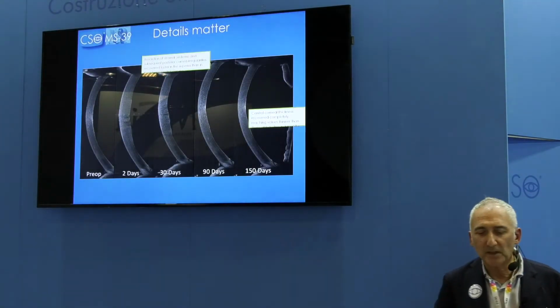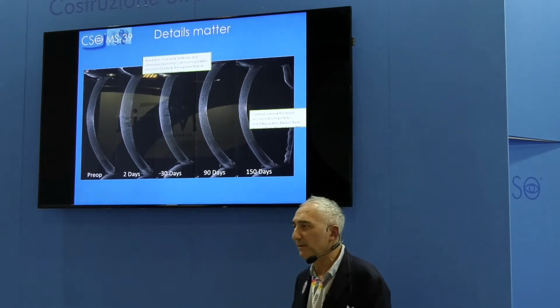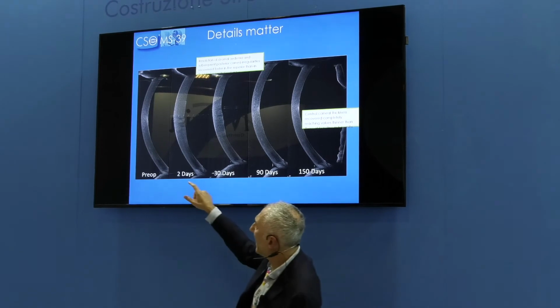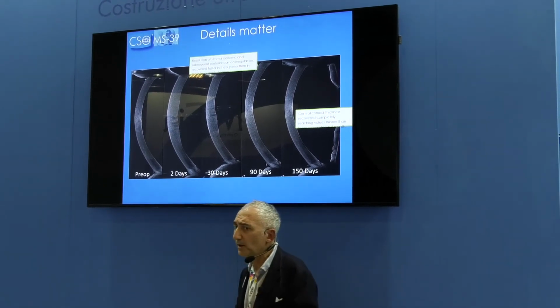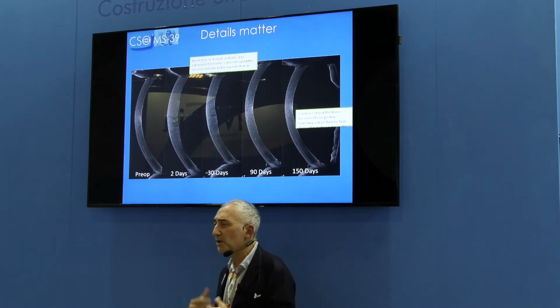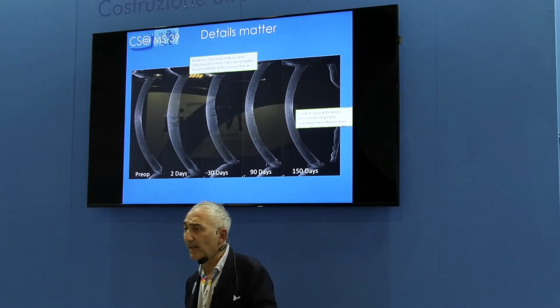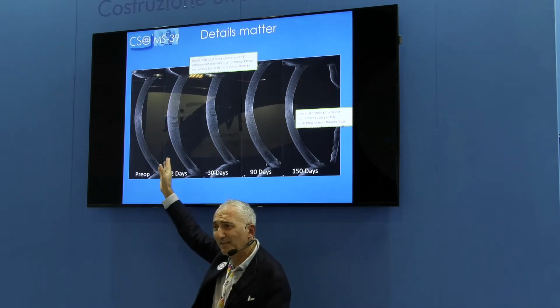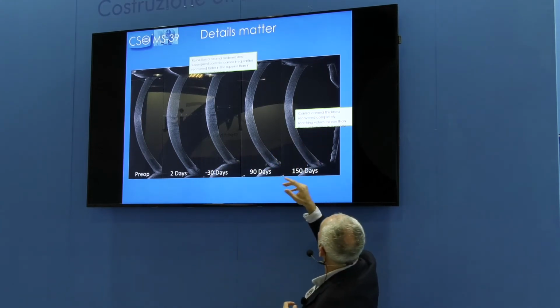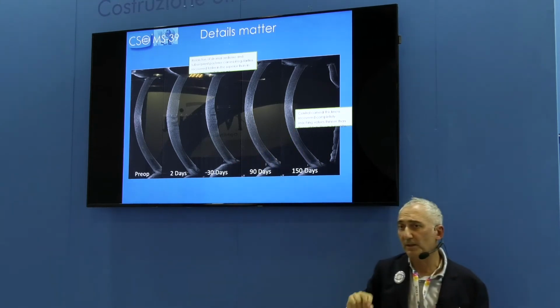Just one more minute, I show you how useful this instrument can be when we perform some other surgery on the cornea. This is a case with initial decompensation in Fuchs dystrophy, and we performed cataract surgery, and we discussed a lot with the patient, but we tried to do primary descemetorhexis without transplantation. In fact, we had a disaster in the beginning, of course, but then you see after time most of the cornea recovered, and also the transparency.